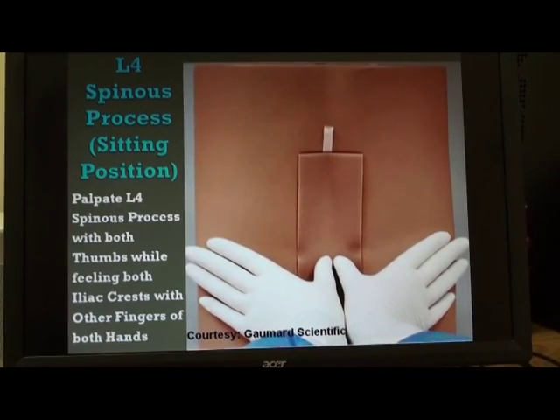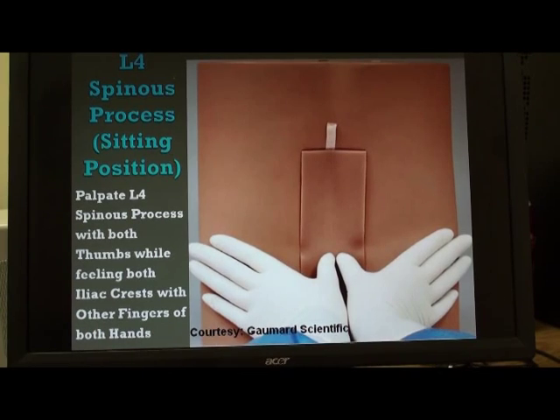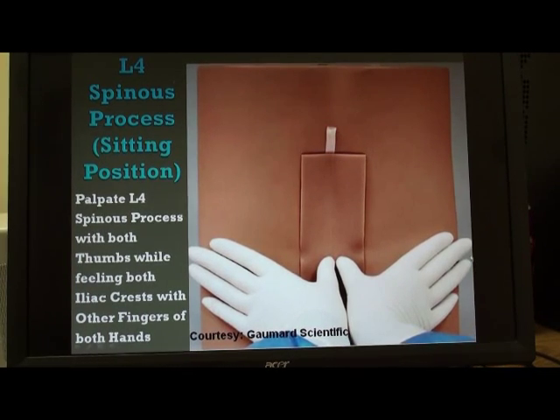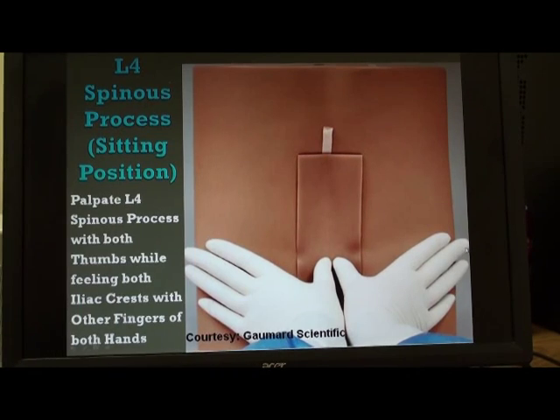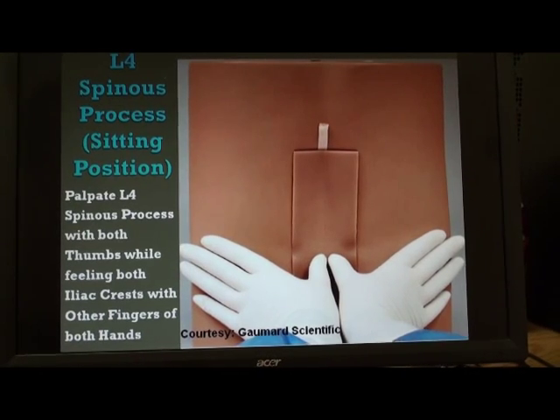This first screenshot that you see in front of you is showing the trainer in the so-called sitting position. The thumbs are located at the L4 spinous process and the middle finger and the index finger are located over the highest point of the iliac crest. This is the technique for locating the L4 spinous process, which is a very important landmark in doing lumbar puncture.